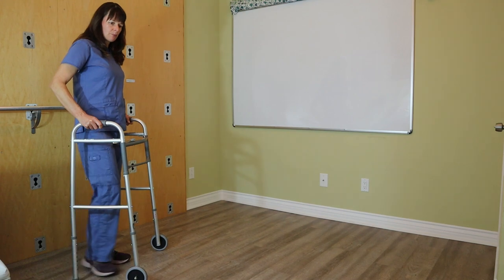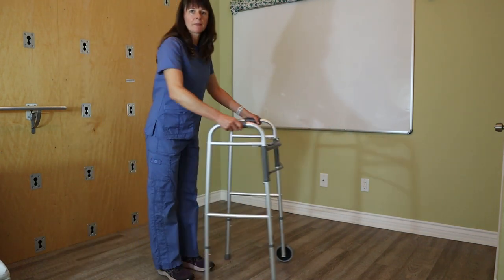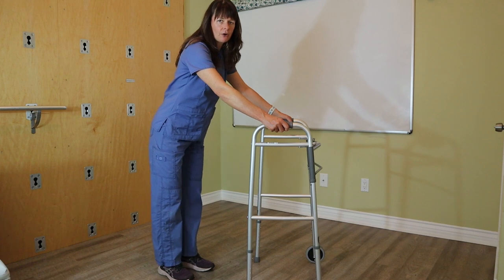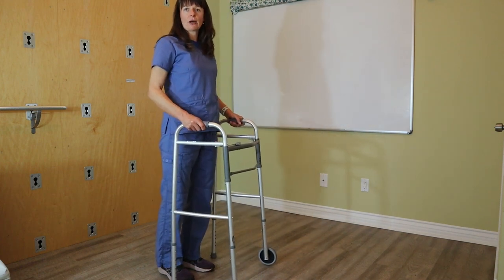The most important thing is that the walker is properly sized and that the patient doesn't put their arm out too far, because that could really throw them off balance — particularly if they are bending their legs or locking out their legs.